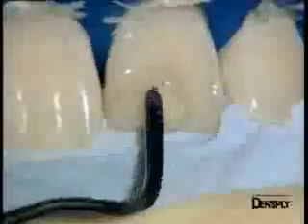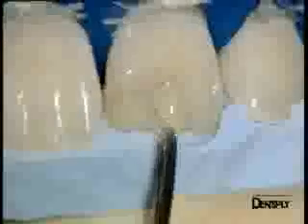The central convexities are then formed, always working the material under compression with the spatula. The desired shape is created through compressing the composite against the tooth, so that it can be placed where one desires.